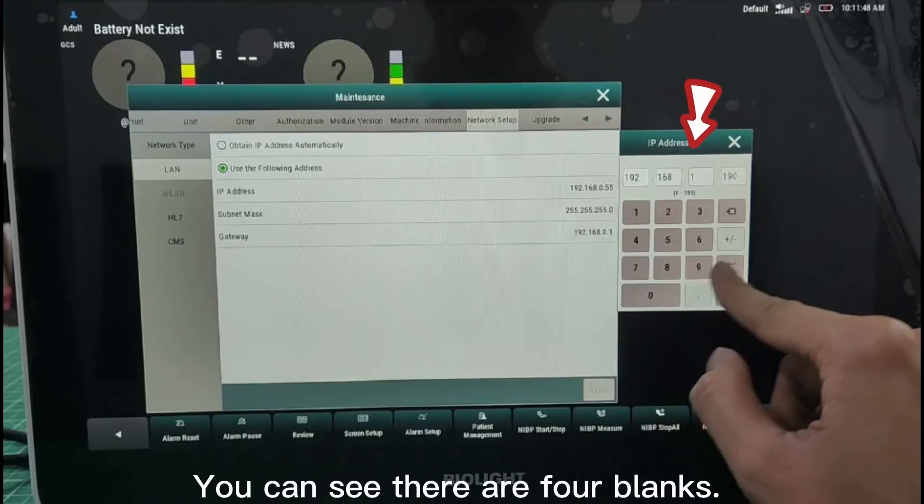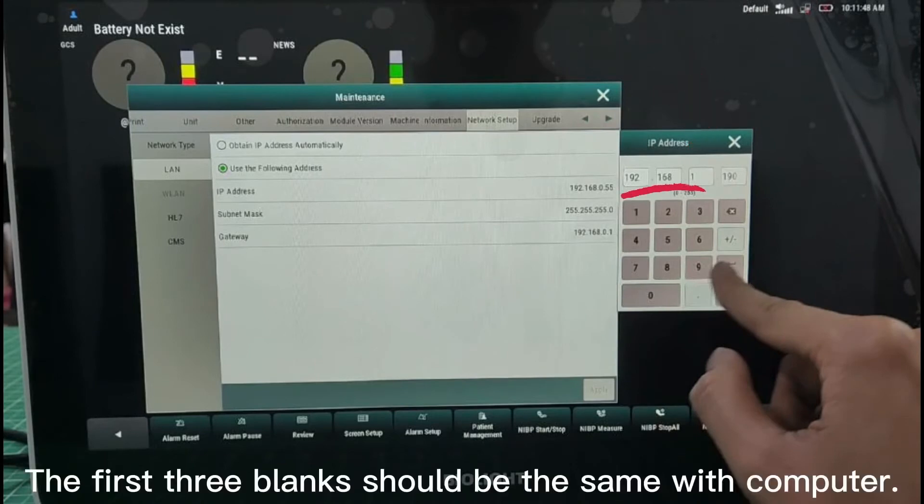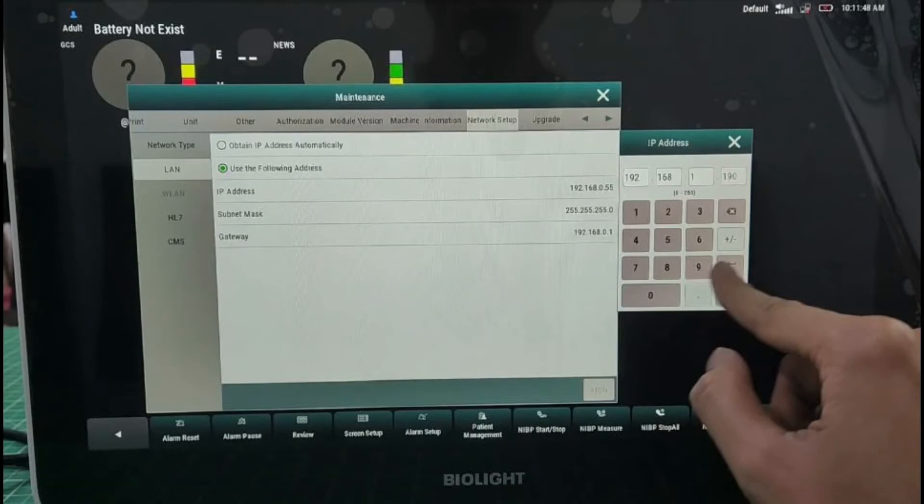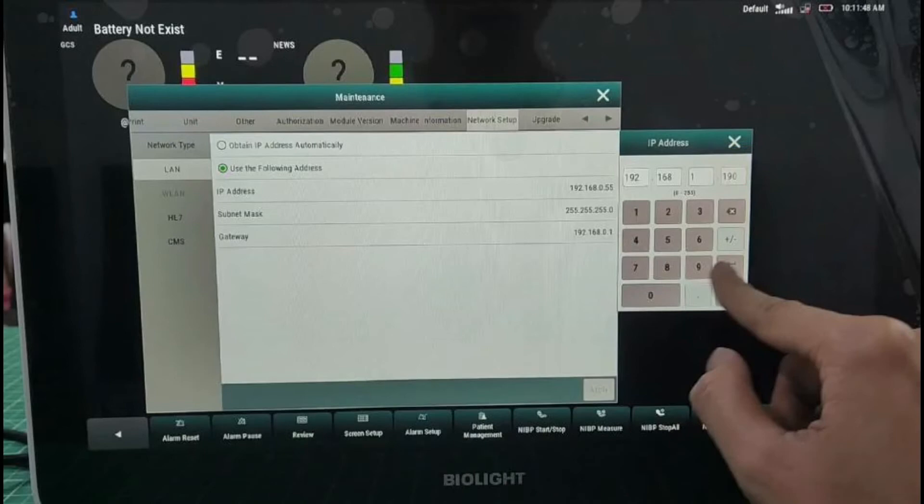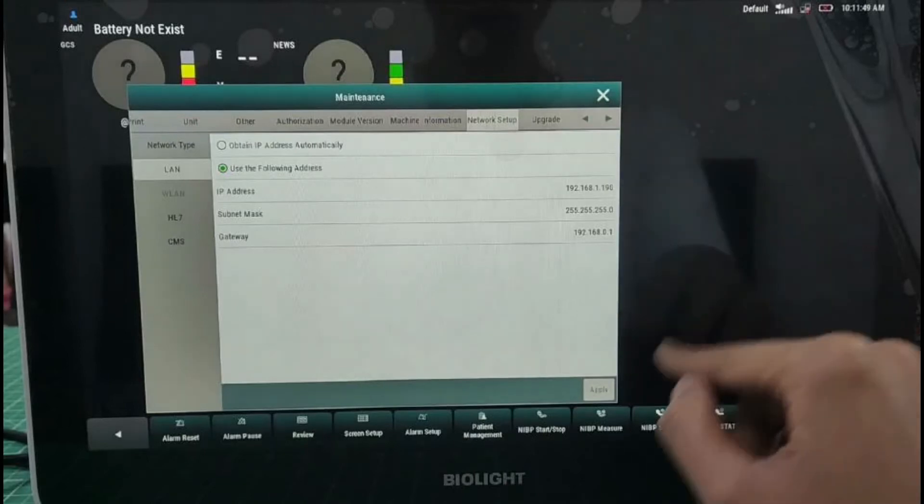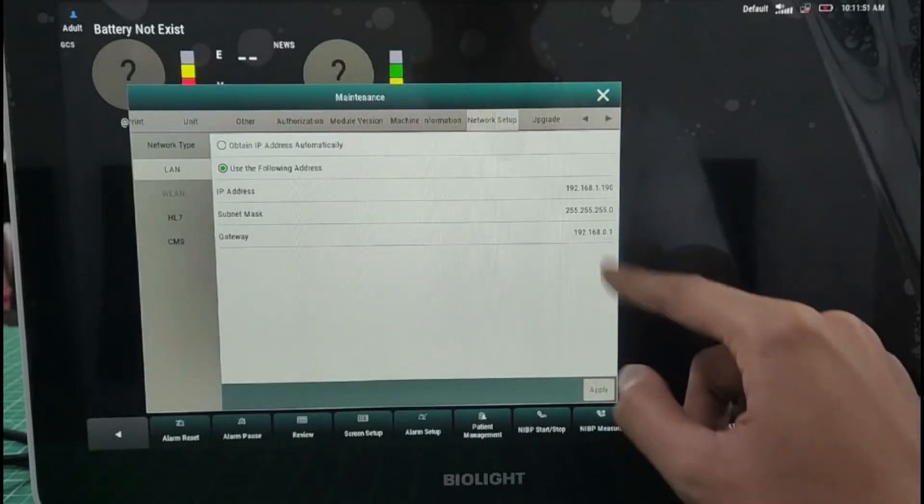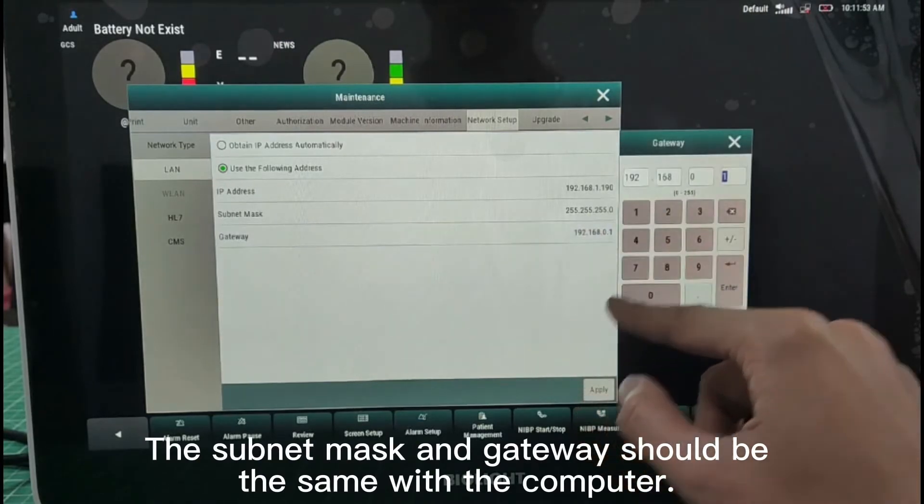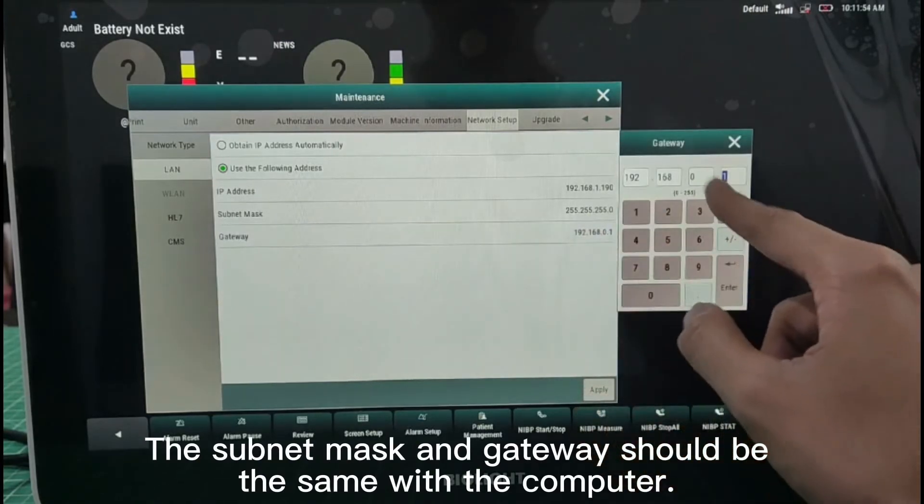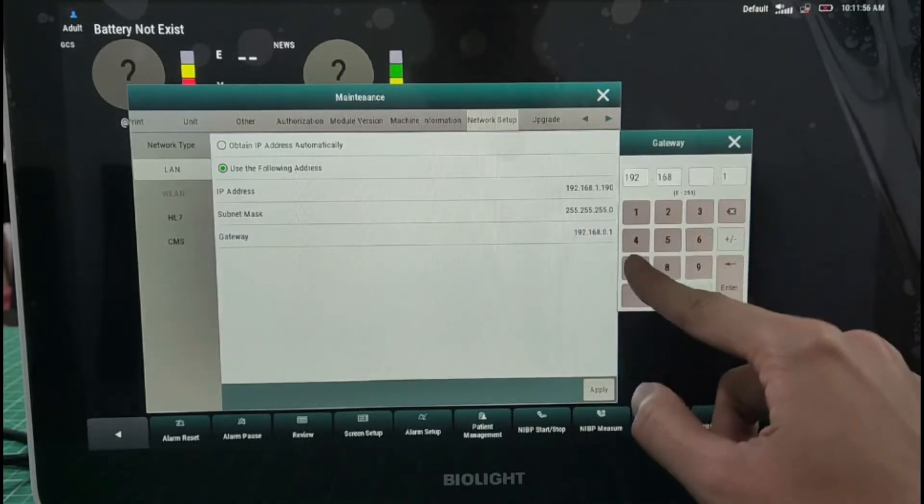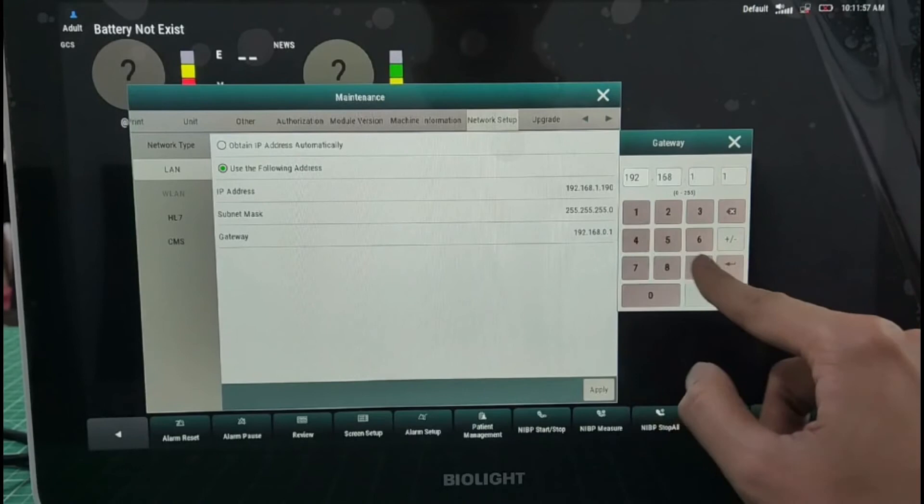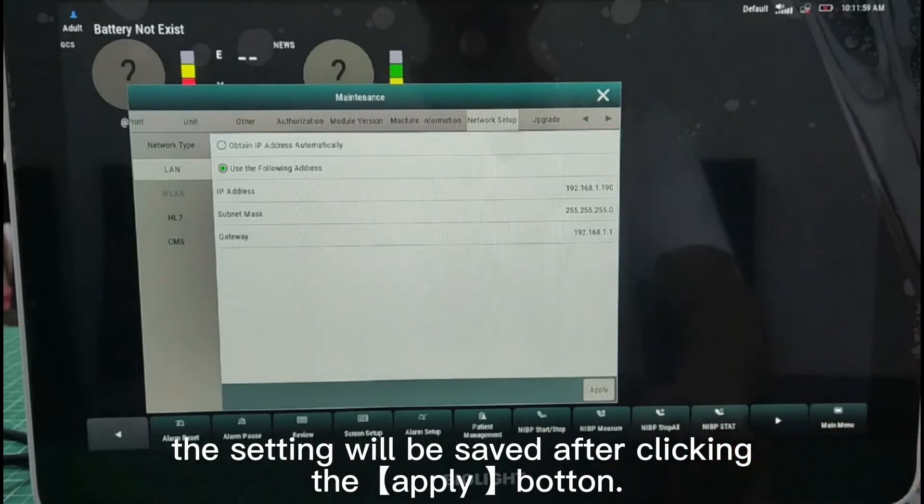You can see there are four blanks. The first three blanks should be the same with computer. The last one should be different from the computer and other monitors. The Subnet Mask and Gateway should be the same with the computer. The setting will be saved after clicking the Apply button.